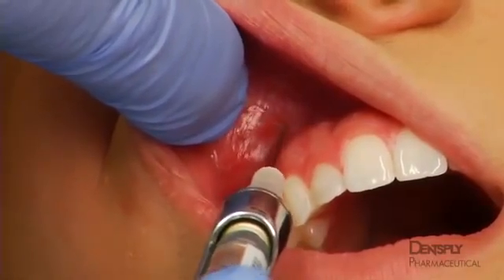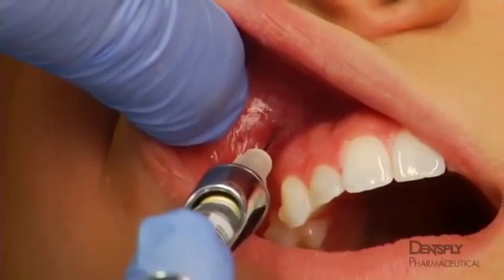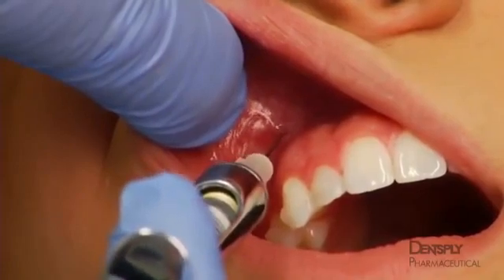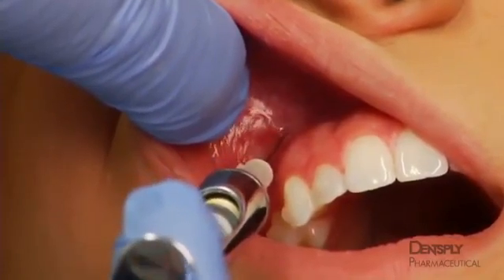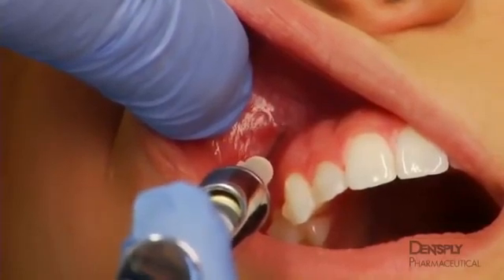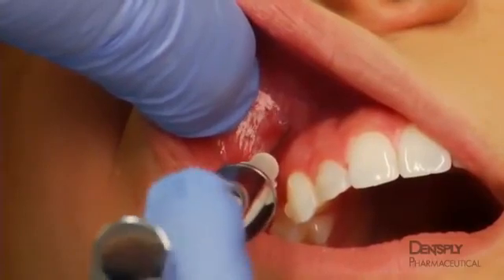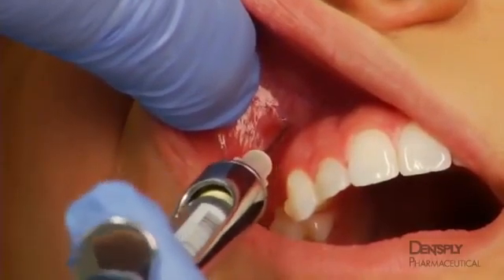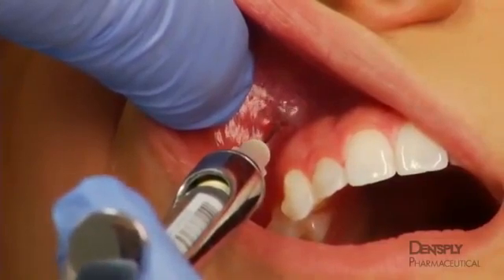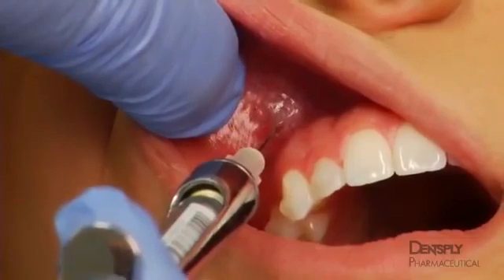Insert the needle at the height of the mucobuccal fold at the apex of the maxillary canine, just anterior to and parallel with the canine eminence, and at an approximately 10-degree angle off an imaginary line drawn to the long axis of the tooth. Aspirate in 2 planes prior to injection. Slowly deposit 0.6 to 0.9 milliliters of solution, about 1/3 to 1/2 of the cartridge, over 30 to 60 seconds.